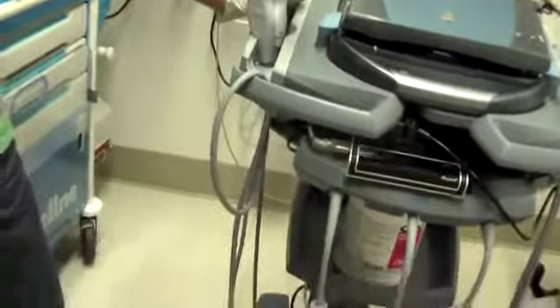So moving along to troubleshooting some of the wiring in the back of the machine. This is your main power strip. It attaches to this gray cable here. Alright, so now you're done tinkering with the machine and the wiring and everything is working correctly.